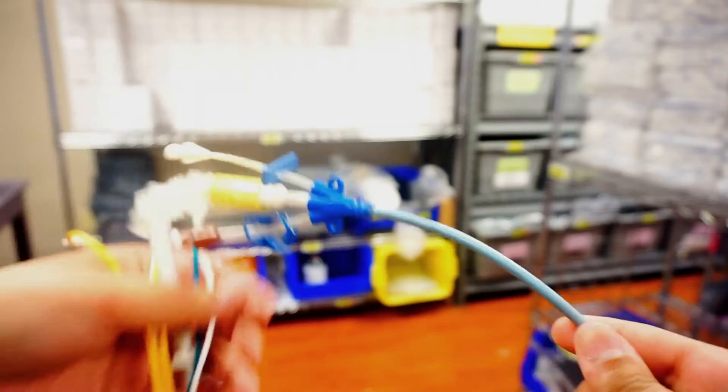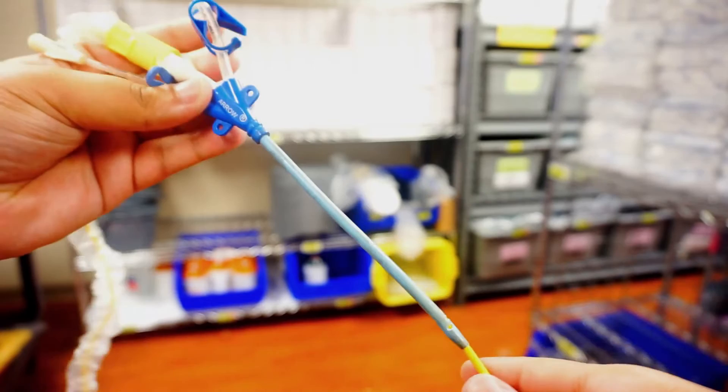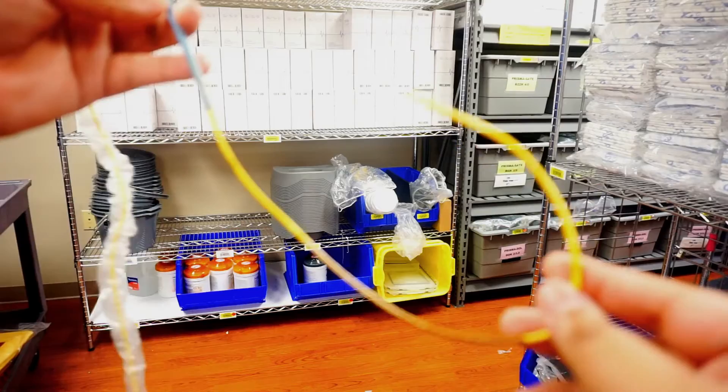Whenever you have the Swan in the cordis, it's going to be going through a central vein into the right atrium, and then it will go into the right ventricle, and then the end will be floated into the pulmonary artery.